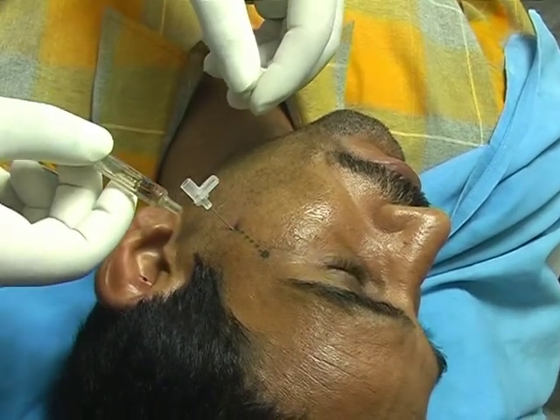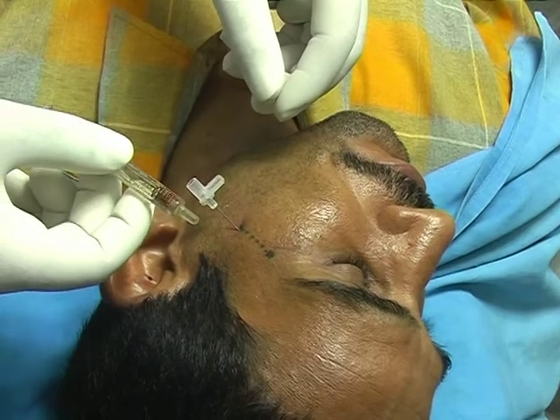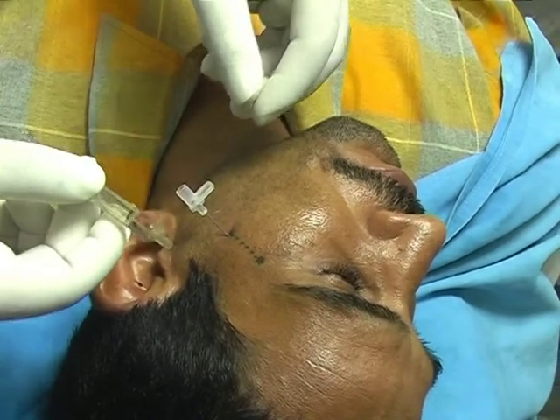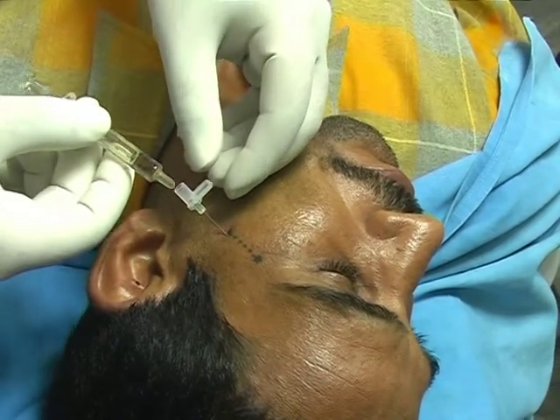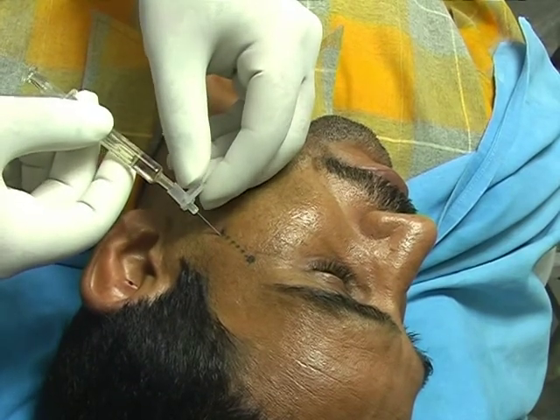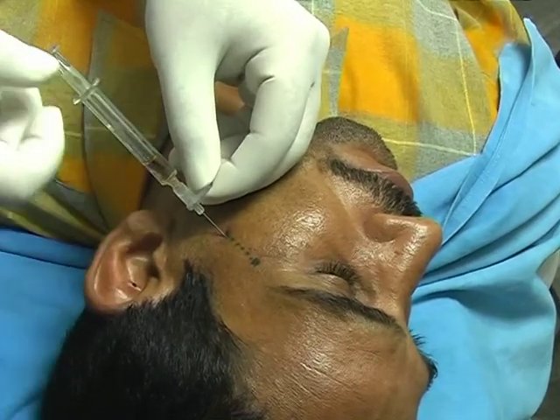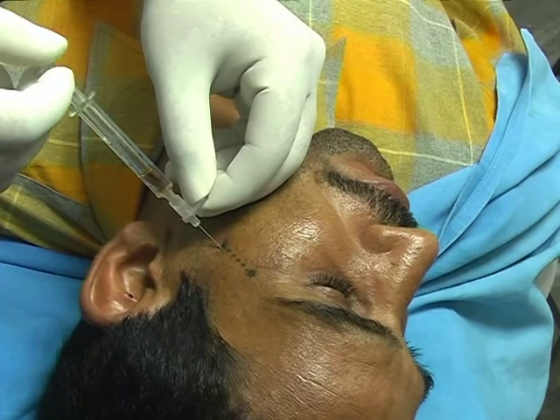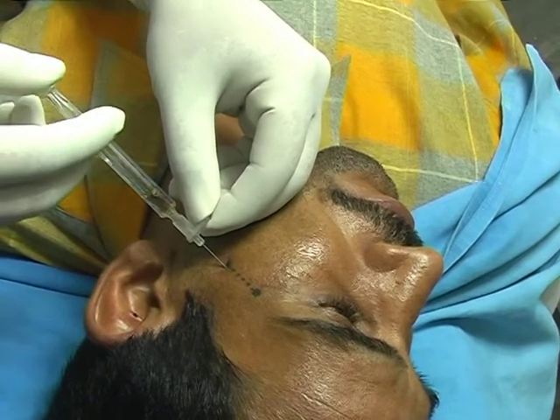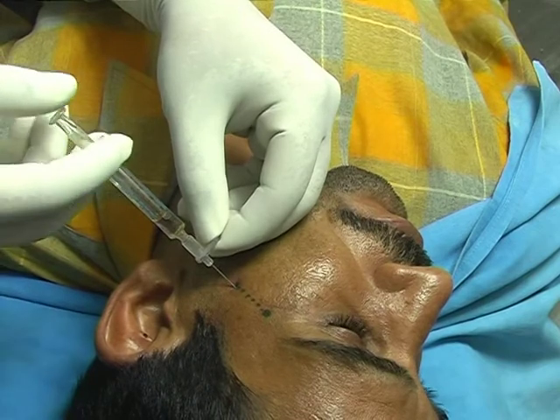1.5% lignocaine solution, just one-third ml, just for a diagnostic block. Always aspirate and then inject, and the free flow of the solution should be there.